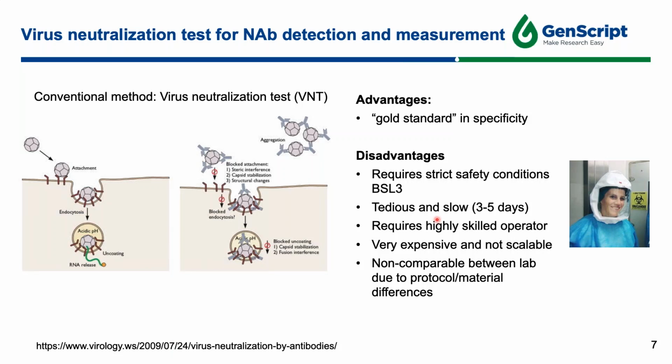And due to the complexity of the assay, it requires highly skilled operators. The assay is also very expensive and not scalable, thus not suitable for high throughput applications. And because of the protocol and material differences between different labs, the results obtained from different labs are often not comparable.